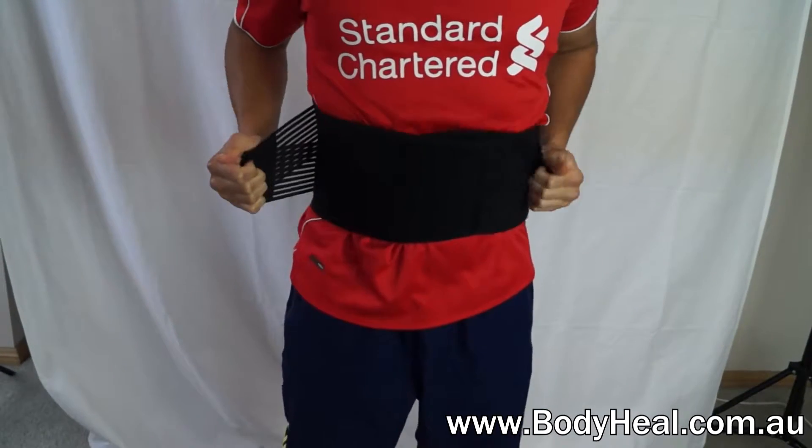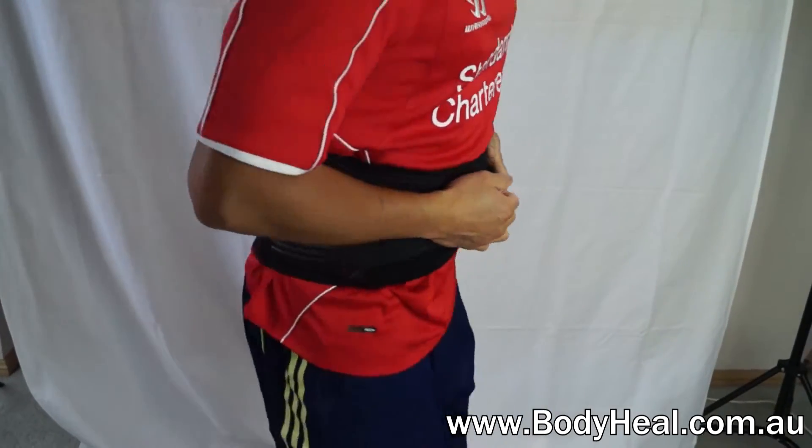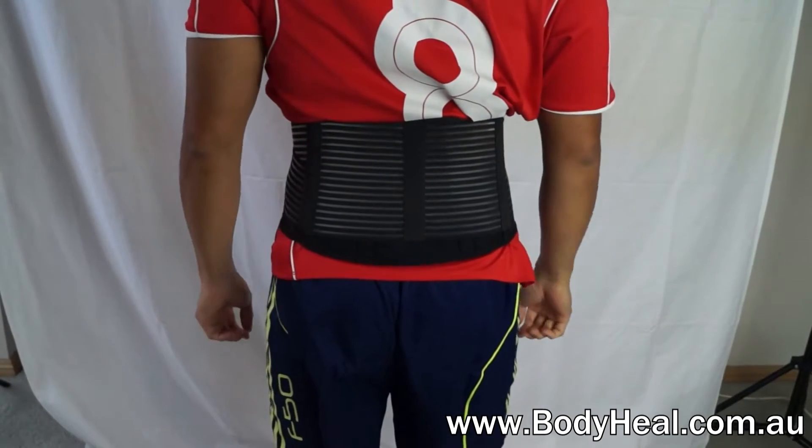It's easy to put on. Hook and loop velcro closures within the vented side panels allow for a comfortable and customized fit, and it's available now at bodyheal.com.au.